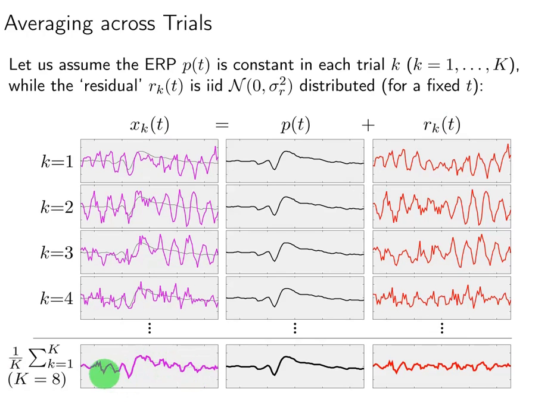the event-related potential by simple averaging, which is, as you can see, very similar to the assumed P of T potential. Here we see some amplitude variation in the noise. If we perform averaging, the noise also gets eliminated in the average signal. So visually we can say that averaging helps if you assume that P of T is constant and the noise is IID.